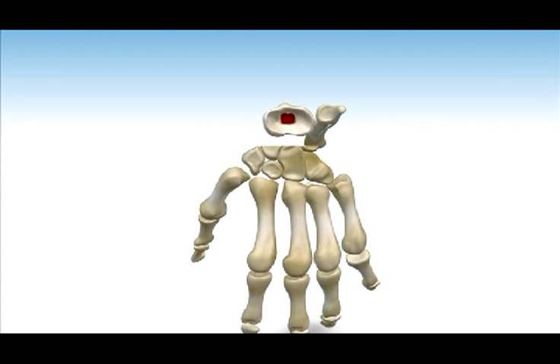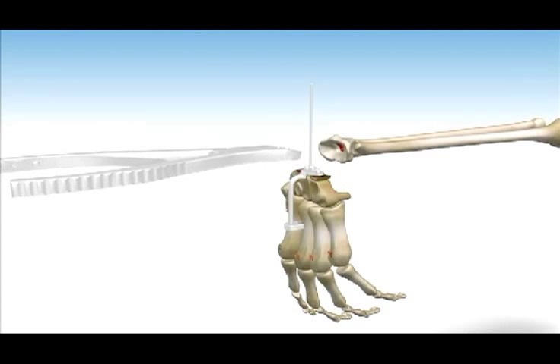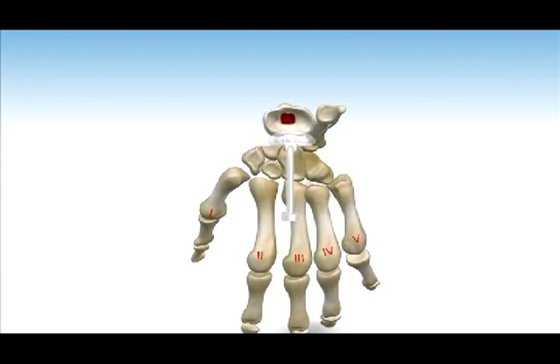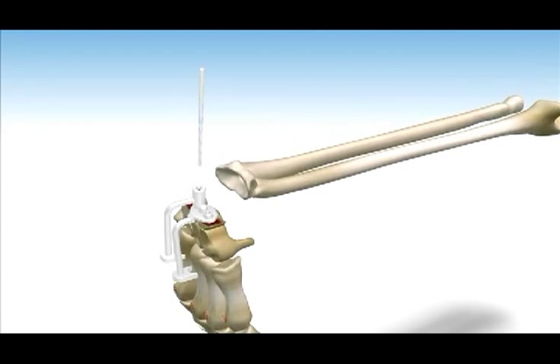Step 4. Position the PGT carpal template over the capitate and third metacarpal. Drill the K wire to the depth of the carpal post length of the implant size that was preoperatively assessed. If trial reduction is desired using the carpal template, then cut the wire and place the carpal ball trial over the carpal template. If desired, the carpal template can be used to prepare the pilot holes for the screws. Use the PGT metacarpal drill guide to assist in alignment over the second and fourth metacarpals. Use of radiography at this point is recommended to ensure proper positioning. Pre-drill with a two millimeter drill bit through the carpal template into the distal scaphoid in preparation of carpal screw placement.